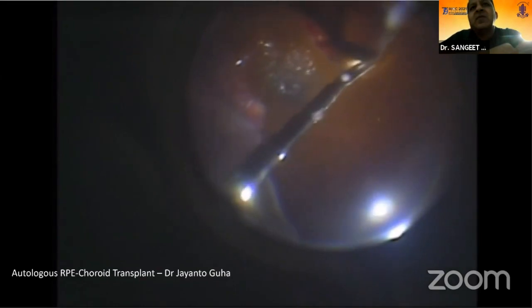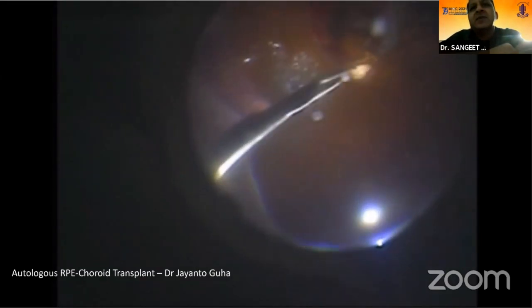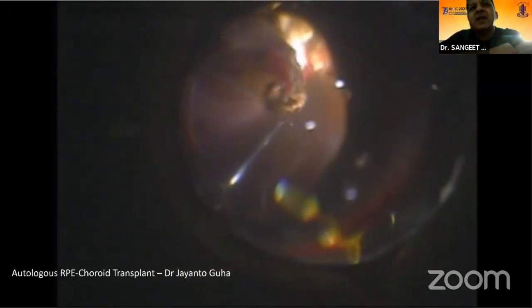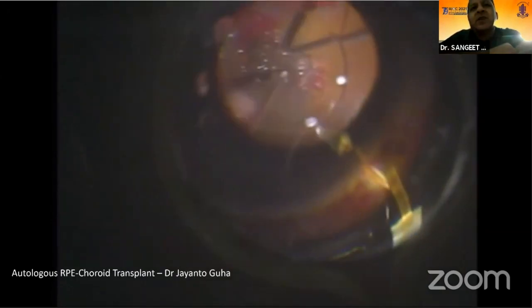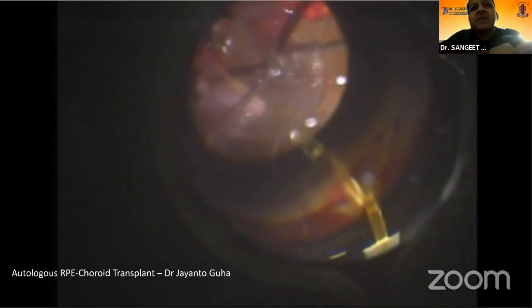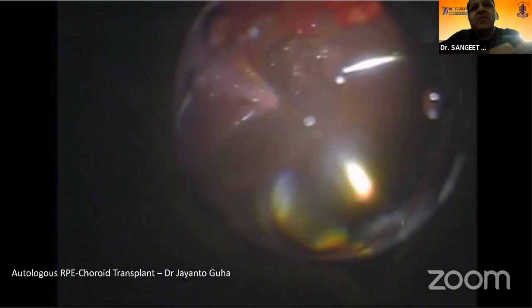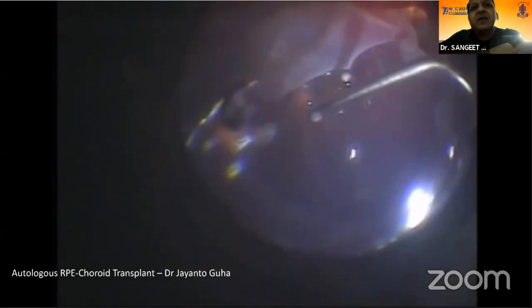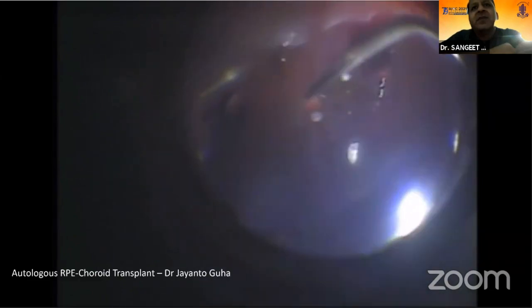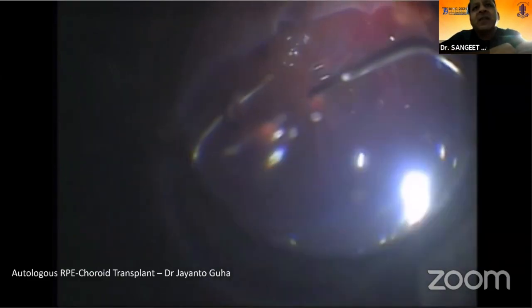And then he slides this graft with the help of end gripping forceps, and he takes this graft and puts it in the macular area. Then he removes the PFCL that was present in the subretinal space, and he uses the same PFCL to flatten the retina.